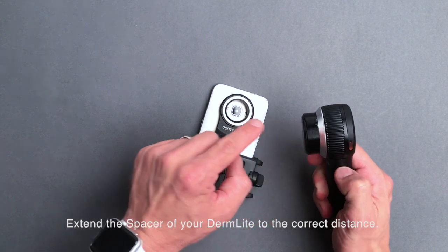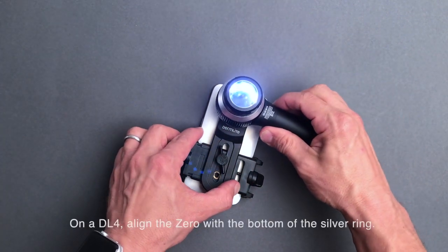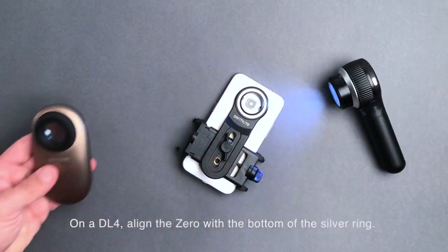Extend the spacer of your DermLight to the correct distance. On a DL4, align the zero with the bottom of the silver ring.